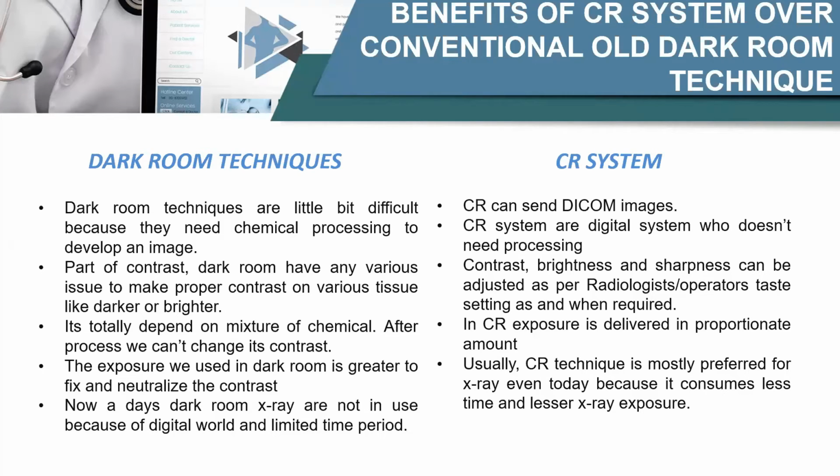We have to make some hassles to get some proper contrast. Contrast here in CR system can be adjusted manually by technicians using the computer. And the quality of the image in darkroom system is totally dependent on the mixture of chemicals. In CR system, we don't need that.